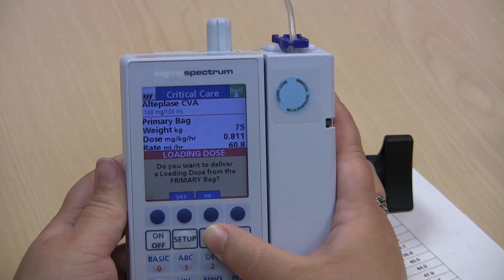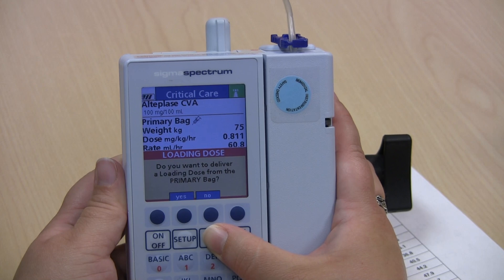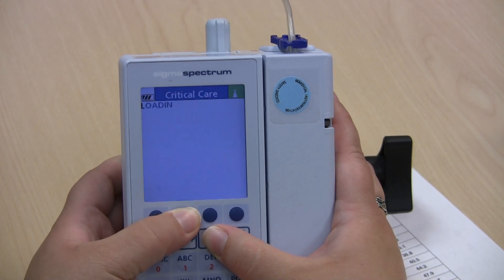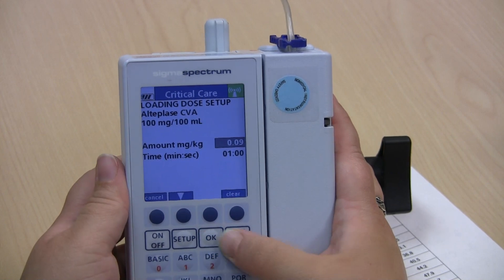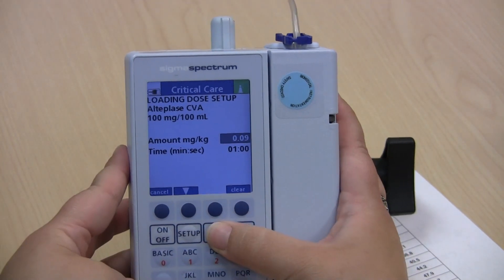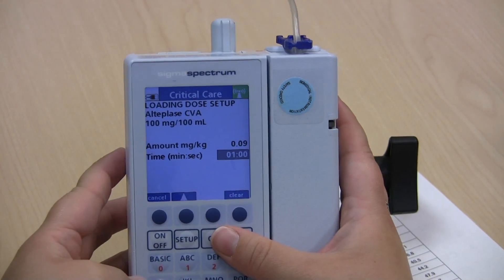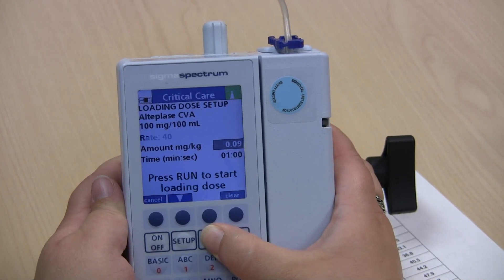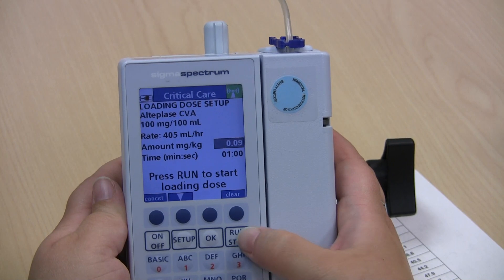Now the loading dose screen shows up. It will ask: do you want to deliver a loading dose from the primary bag? Yes. The amount in milligrams per kilogram should be preset at 0.09 — press OK if that is the case. The time should be set to one minute — press OK if that is the case. Then press Run to start your loading dose.